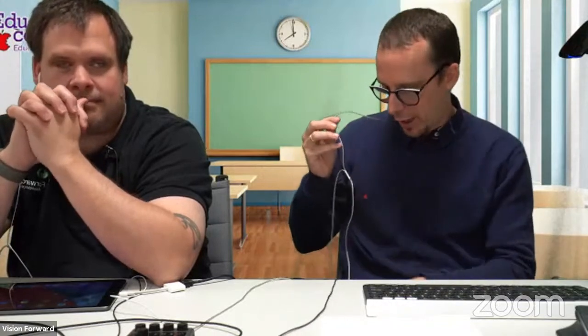But yeah, it's kind of expensive. Assistive technology devices usually are, which is why, obviously, you can use quota funds if you're going through the schools. But it's always worth investigating the low-tech features first. Yeah, for sure. I'm going to stop talking because I've been talking for a long time here.